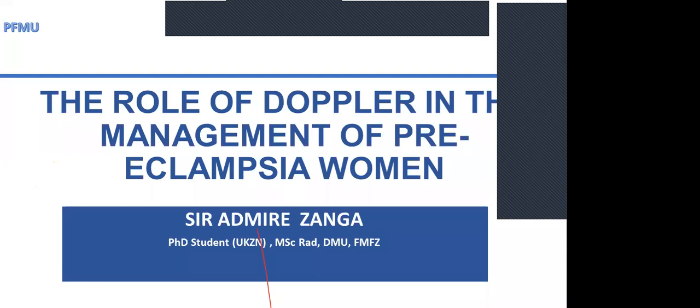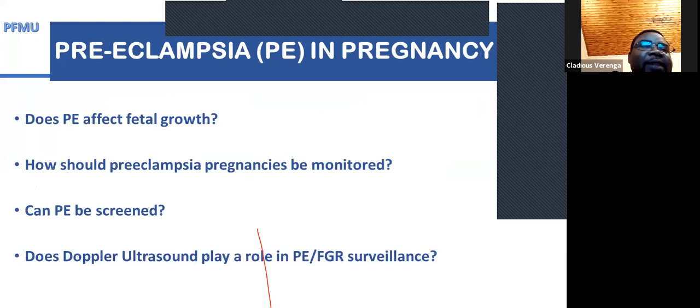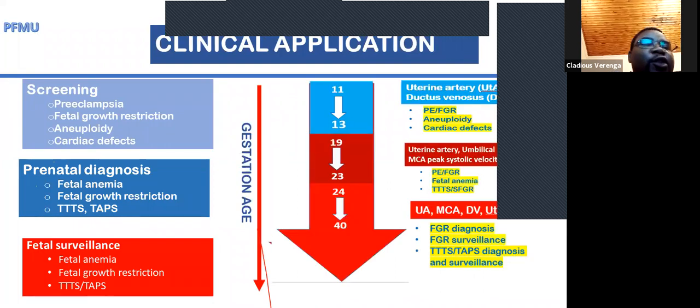Thank you for that. Dr. Claudius Verenga, you may go ahead with your question or contribution. Hello, thank you so much, Chair, and thank you so much, Admire, for the wonderful presentation. I just wanted to comment on the MCA, on when we should start doing it. From Admire's first slide, you saw that Doppler has multiple applications in the care of pregnancy. One of the most critical roles of MCA, if you look at table number 2, the one in blue, is where it is written fetal anemia, TTTS, and TAPS.